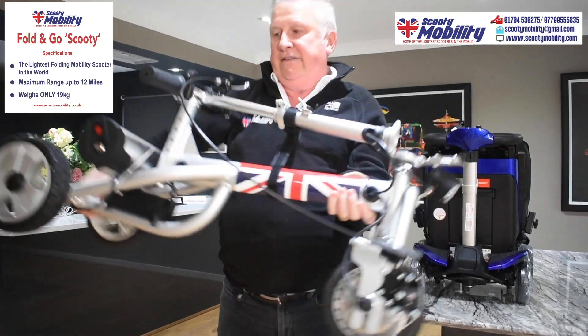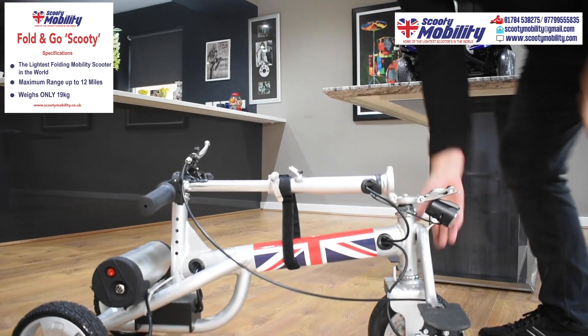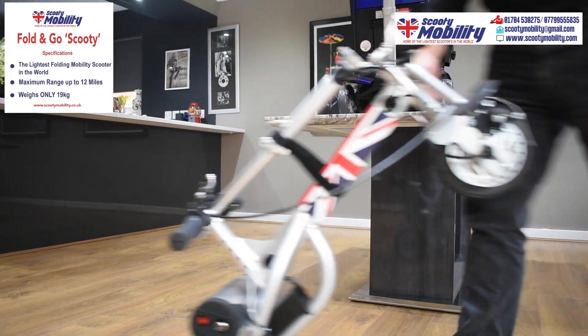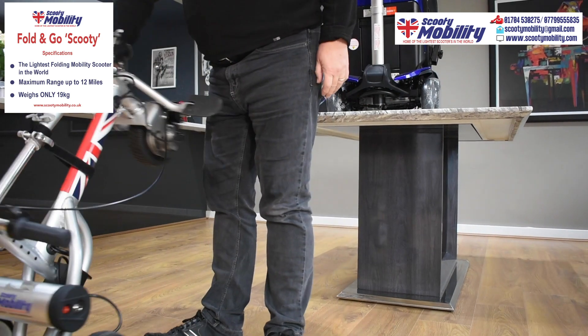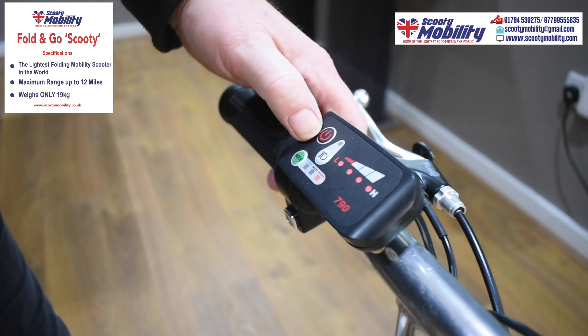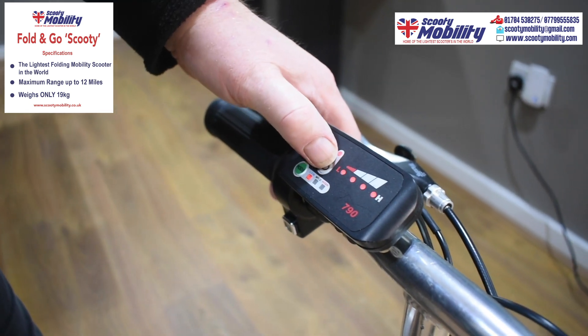It does up to 8 miles per hour, with speed settings of 3, 6 and 8. You can wheel it around and take it up to the boot of the car — maybe put the front wheel onto the car boot and lift from the back to make it even easier to lift into the boot of your car. Speed settings of 3, 6 and 8 miles per hour.